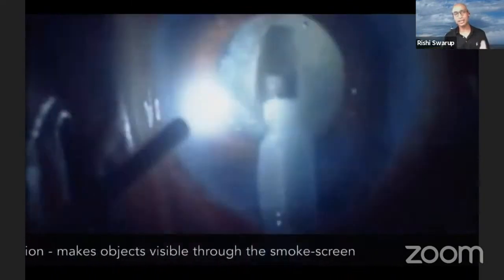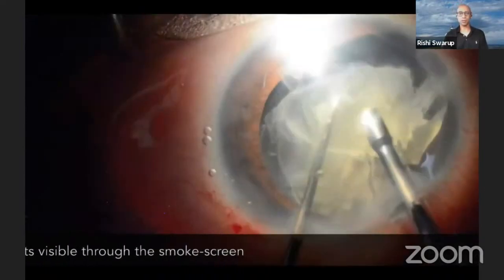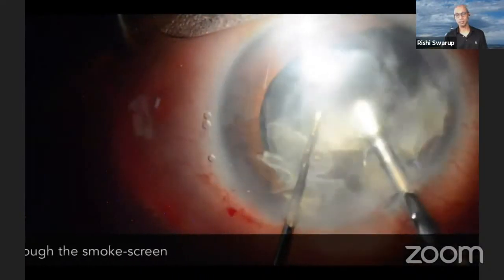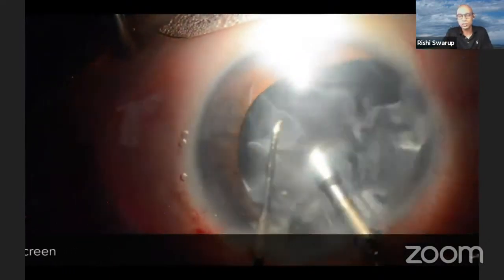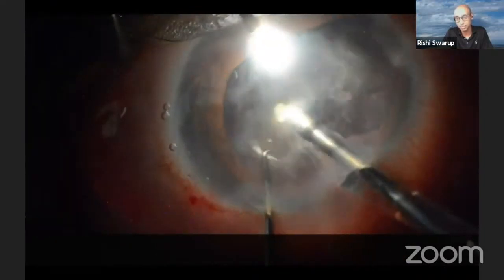You can even put the light inside the anterior chamber through the side port and help visualization better. So here, the visualization looks like you're just seeing a regular cataract, but once the endo illuminator stops, you'll realize that there's quite a dense central corneal opacity there, through which operating with the stereo coaxial illumination of a microscope would not be very safe.